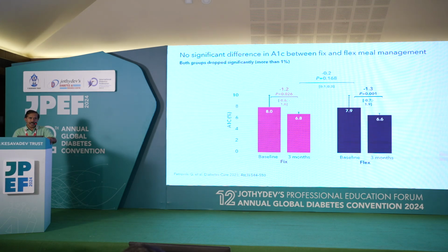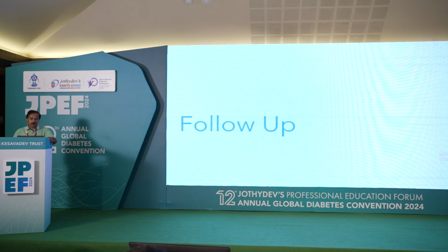There is a significant decrease in hemoglobin A1C when someone is doing proper carb counting and using the pump, and also when someone is just announcing the meal, like whether it is a major meal or a short meal, the three targets they are doing, and still we are getting a better outcome. So this is actually encouraging for our children also.